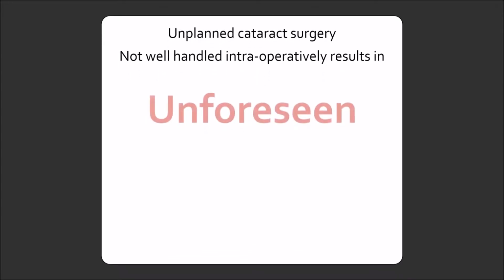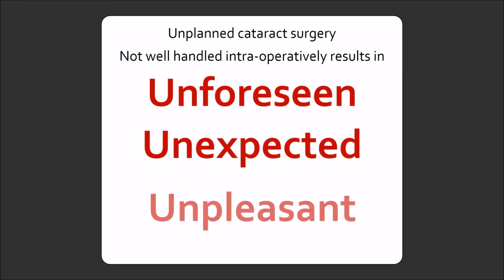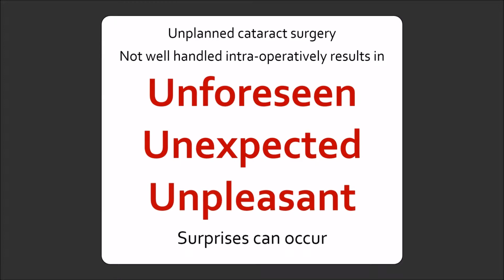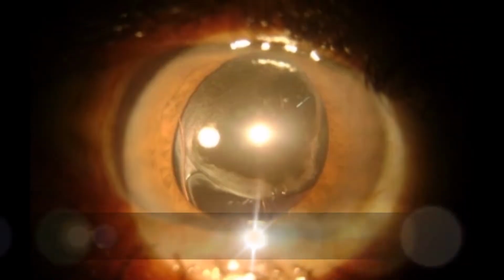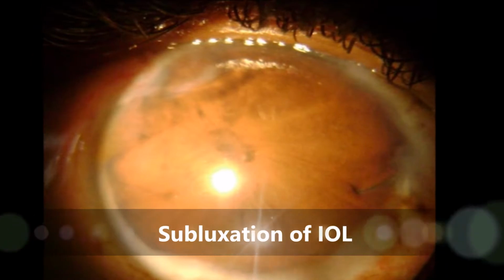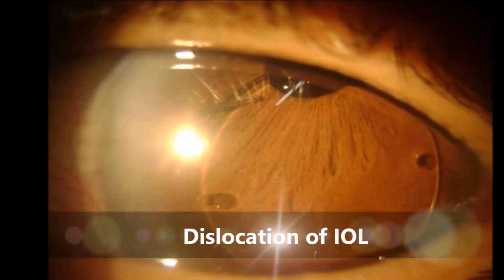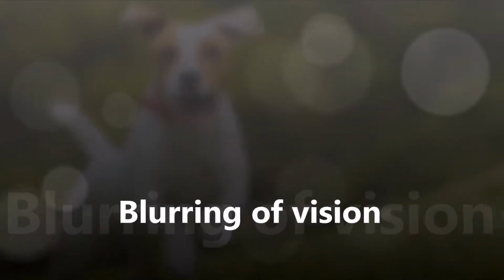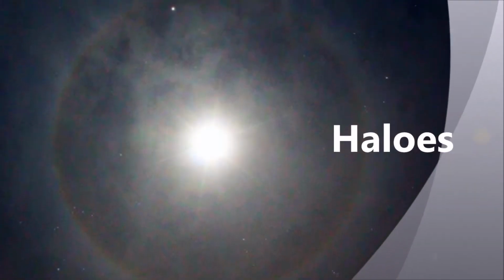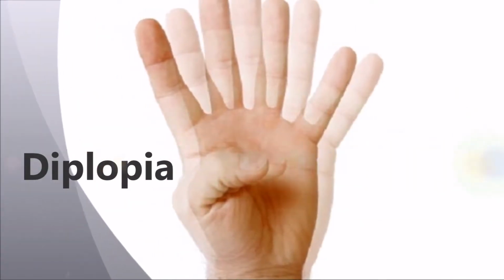Unplanned cataract surgery, which is not well handled intraoperatively, results in unforeseen, unexpected, unpleasant results and many surprises. They can cause malposition of IOLs: decentration, subluxation of IOL, pupillary capture, dislocation of IOL, and they can cause symptoms like blurring of vision, halos, recurrent inflammation, sometimes diplopia, and even glare.